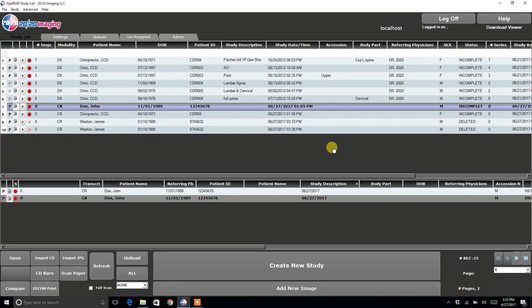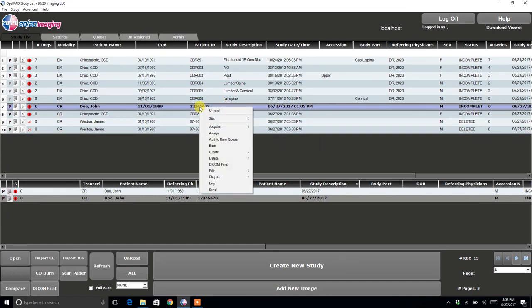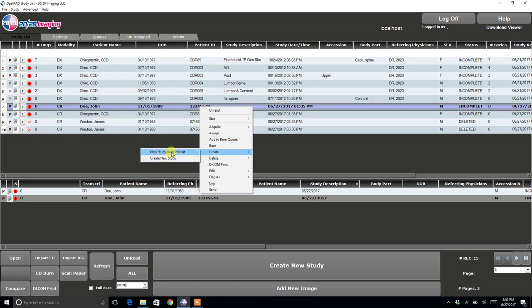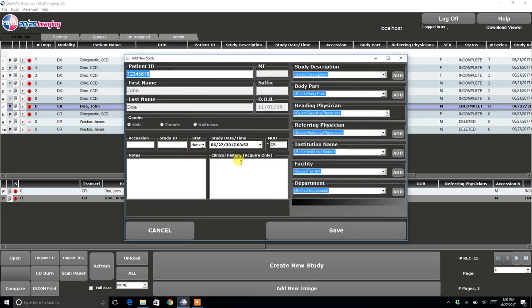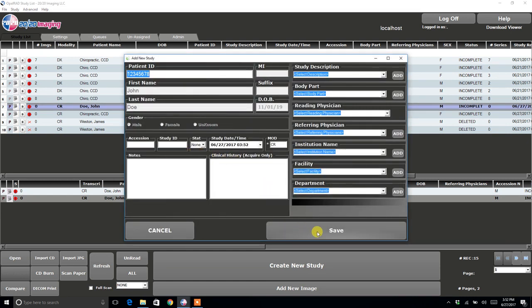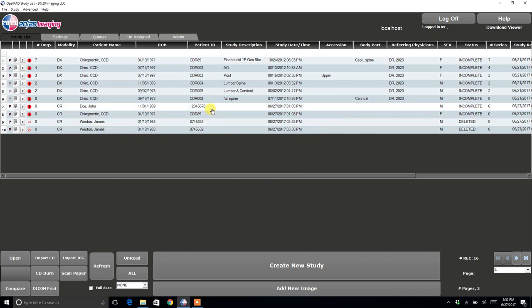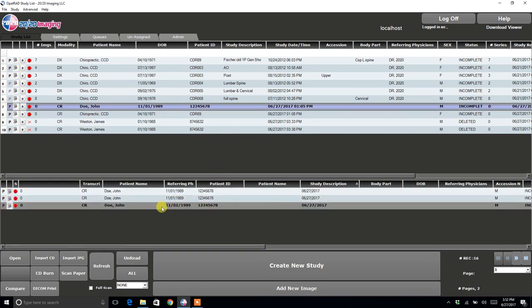So if you have a patient returning for follow-up x-rays, you will want to select the patient, click Create New Study from Patient, then Save. And then if you go into the patient, you will see the new study created.